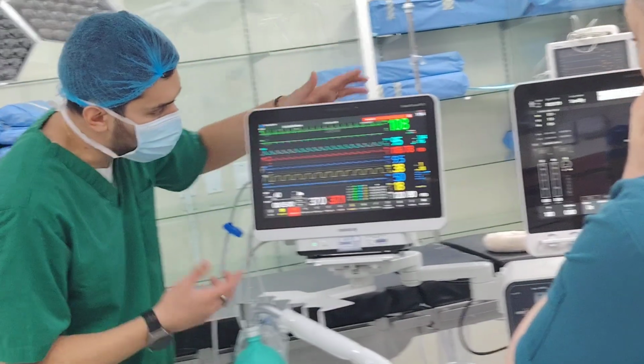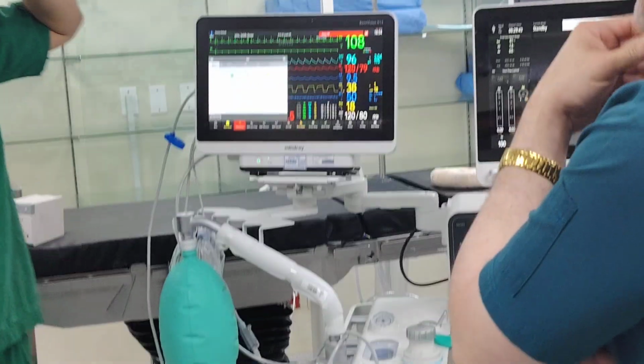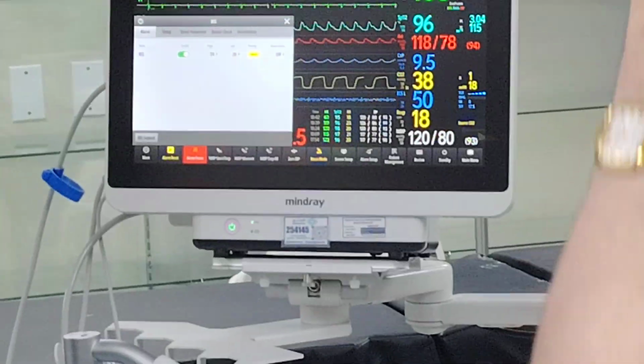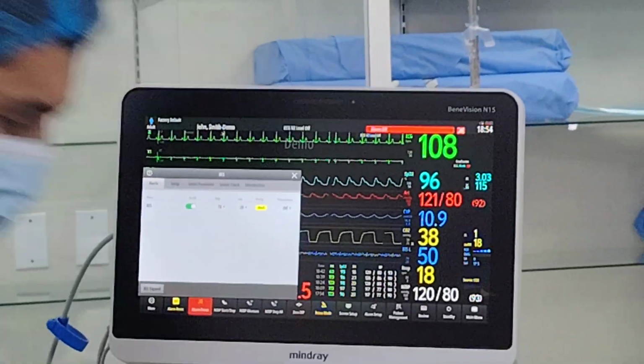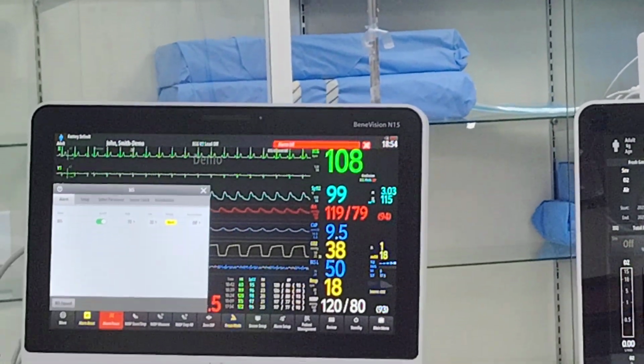Now BIS is very, very straightforward. BIS is here. You click on BIS. After you attach the accessories, one of the biggest problems, you have it here. Okay, it's expensive.